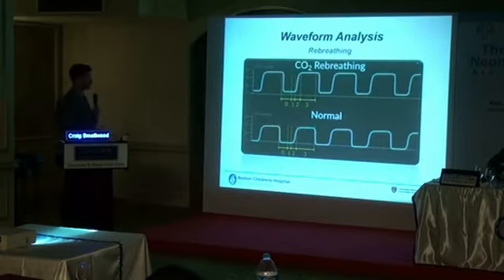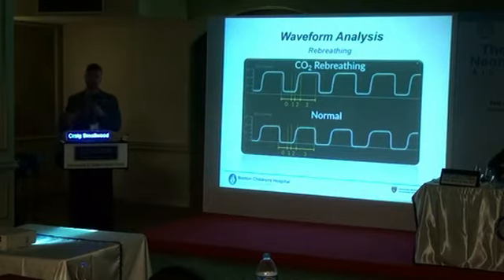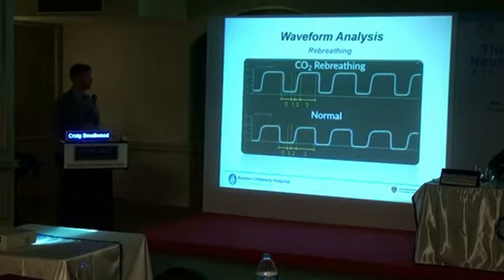So what about rebreathing CO2? That's an easy one to pick up. I said hopefully none of the CO2 is being inhaled, but sometimes with newborns with rapid respiratory rates, perhaps if you're unable to get to high frequency oscillatory ventilation in time, you're cranking up the respiratory rate to improve ventilation, and you may find yourself in a bit of a pickle.